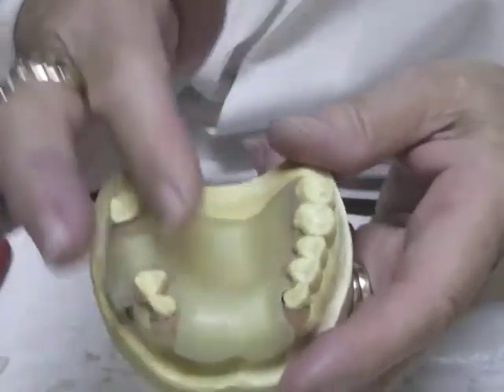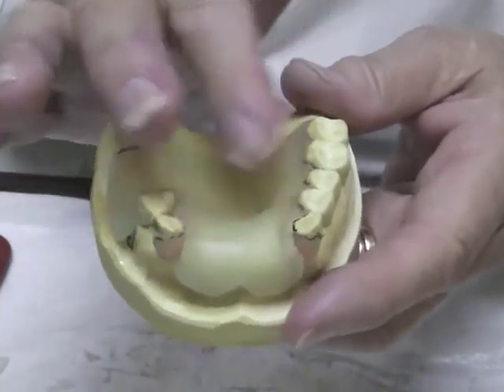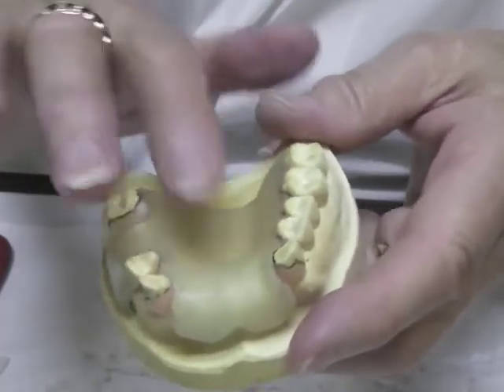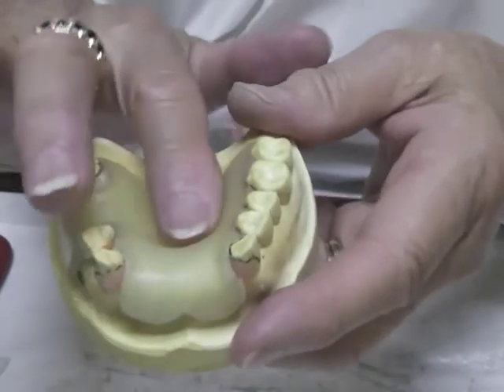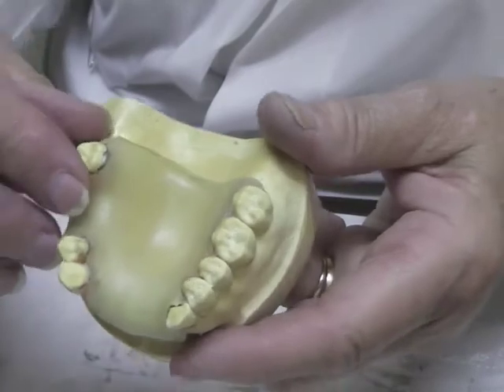Make sure the palate is adapted well and that there's not a trapped air bubble down in that area. You should have worked that out when you started, because if there's air under there at this point it's just going to move from one place to another — you will end up with some air bubbles.